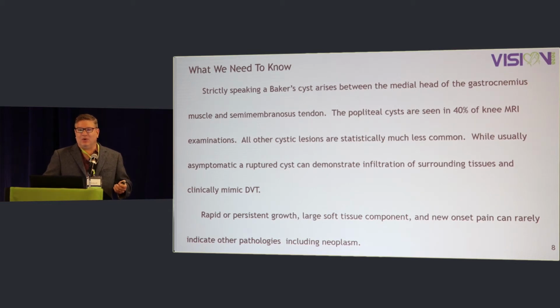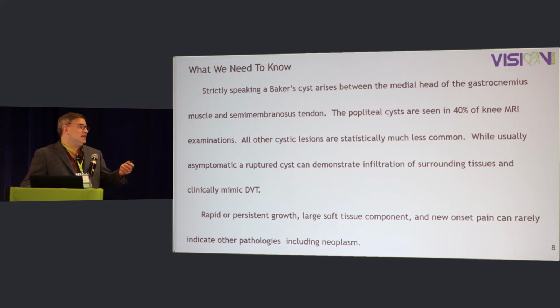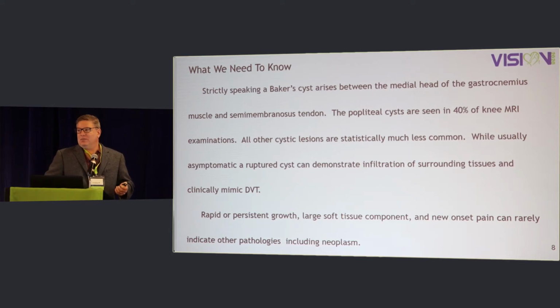You don't really have to worry if it's a cystic lesion. You start worrying when the thing is getting bigger and it's changing, it's mostly soft tissue. Yeah, you can think about it a little bit, but I don't know if anybody here in this room actually has had a soft tissue mass behind the knee turn out to be a tumor. I think everybody's seen hundreds of Baker cysts, and it's just so common that it's hard to want to be thinking about the other things.